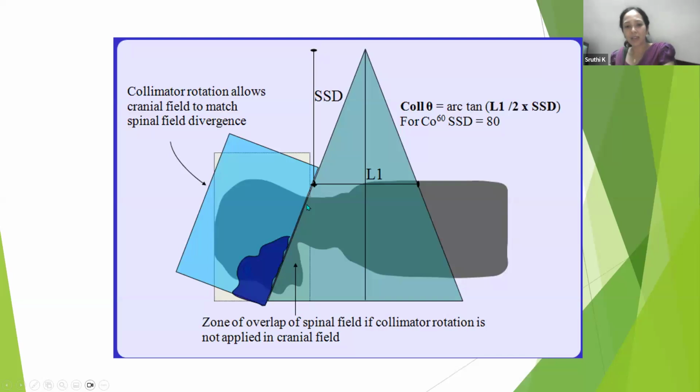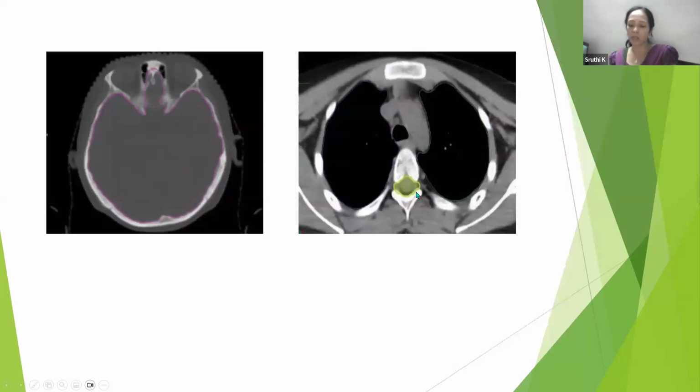And we always have a lot of technical issues in craniospinal irradiation. It is one of the most complex procedures in radiation therapy, and I'm sticking to the basics because it's a little complex. You should know that radiation therapy is very conformal nowadays. So you can see this is the treatment volume here. You're covering the entire craniospinal axis here.